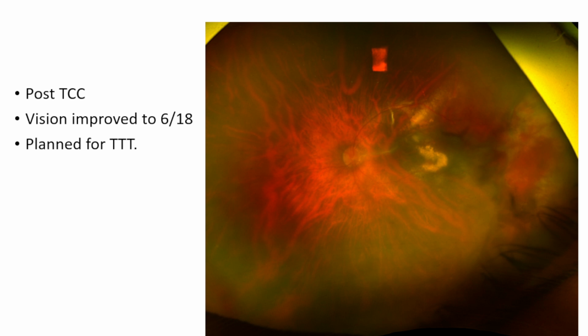Actually, the last patient I saw today was this patient. You can see that reddish area. Can you point out the tumor? Yes, so that is the VPT. It is more temporal compared to the conventional location.